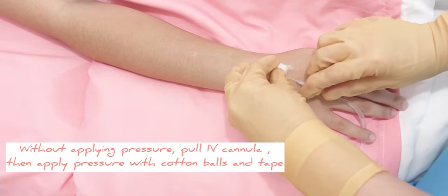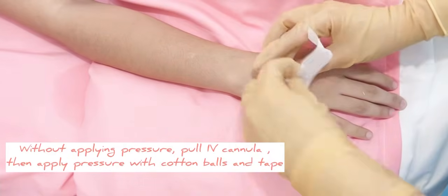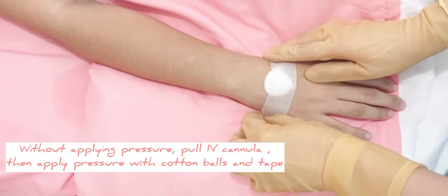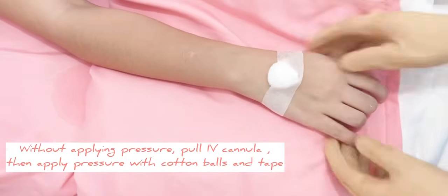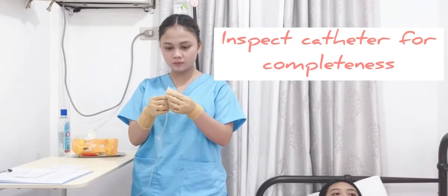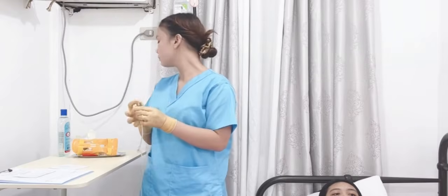Then without applying pressure, pull IV cannula, then apply pressure with cotton balls and tape. Then inspect the catheter for completeness, which determines if catheter's tip is intact.